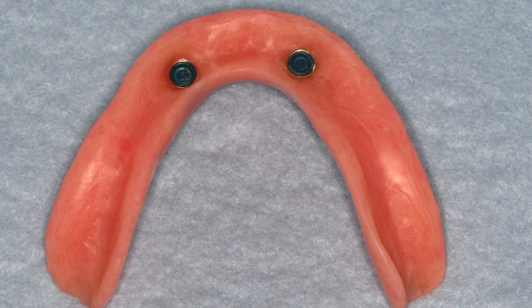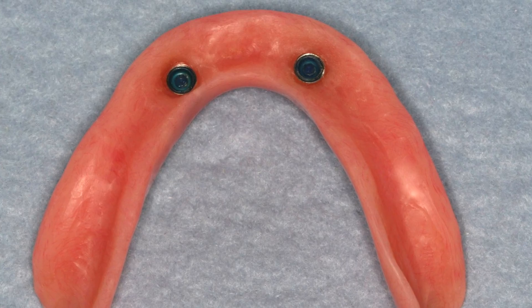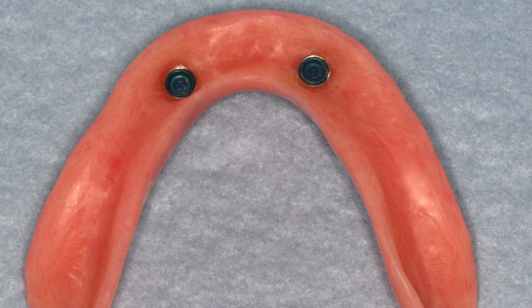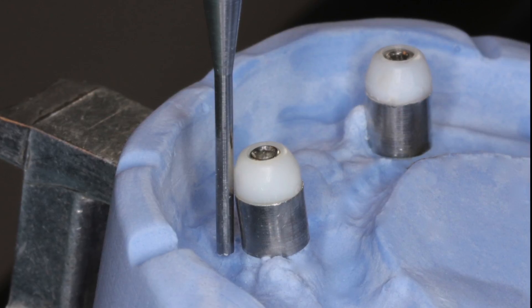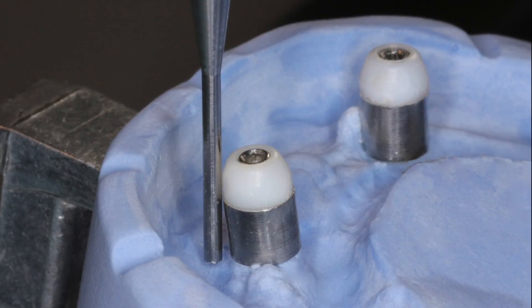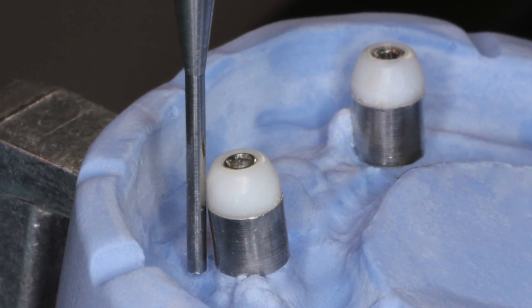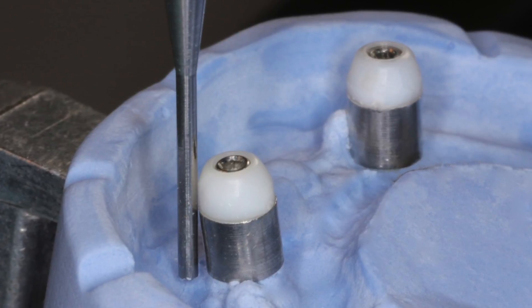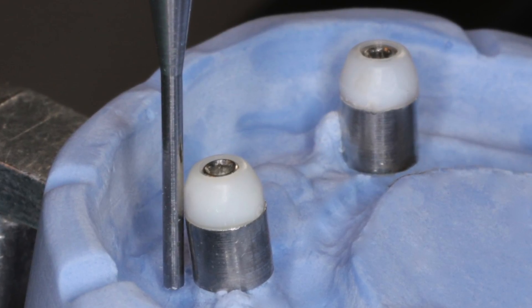Implant overdentures are desirable options for edentulous patients because of improved retention and stability. While it is recommended that implants be placed parallel to each other, it is not uncommon for implants to be oriented with varying degrees of divergence. Occasionally, clinicians will encounter abutments of sufficient divergence in height that the denture cannot fully seat due to interferences with the denture base. If an attachment can't get to position, retention will be decreased.